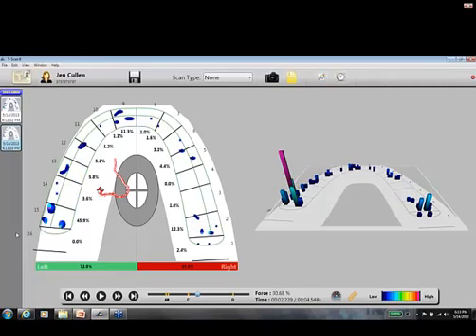Now let's look at how number 2 stays in. So this is the things you're looking for, and I know you guys are doing this in your practice, but I wouldn't like that number 2 hangs in there. And number 15 has 45% of the force on it. If I had an ideal bite, I should be up here. So these are the things that you're going to talk to your patient about. See, I just kind of hang out on 15 for a while.